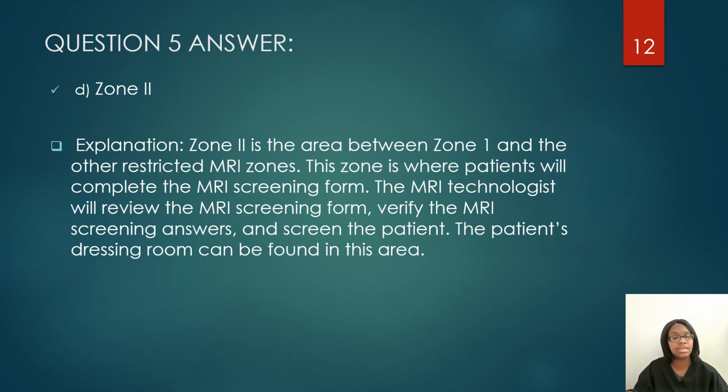So always go back over the form with them, and also get them to change into a hospital gown or hospital scrubs, a clinic gown, clinic scrubs. I always have patients change because they may forget something in their pocket. They may put something back in their pocket. They may have implants they forgot to tell you about. So it's just good to have them change. And even so, they may have material on them that can heat up. So you just never know. And if a patient or someone does say, why do I have to change? Then just tell them it's your company's policy.